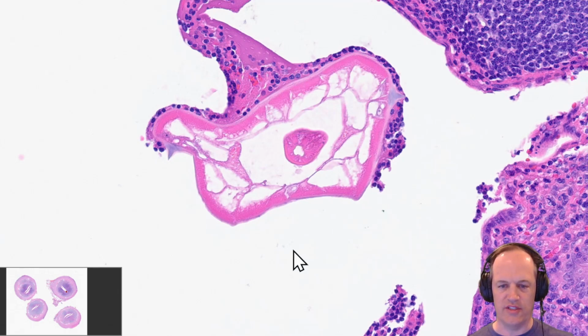So the treatment for this obviously is going to be a little different than your standard treatment for appendicitis, because their abdominal pain is probably related to the worm. So these worms are really distinctive because they have these lateral spines, and they have an intestine right here. Yeah, that's Enterobius vermicularis. Yep.